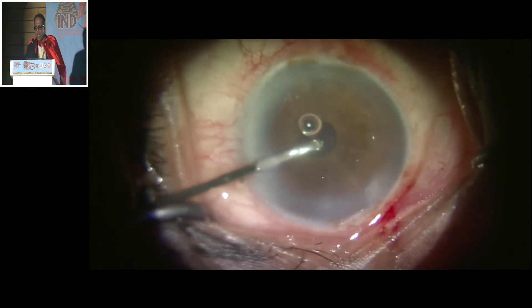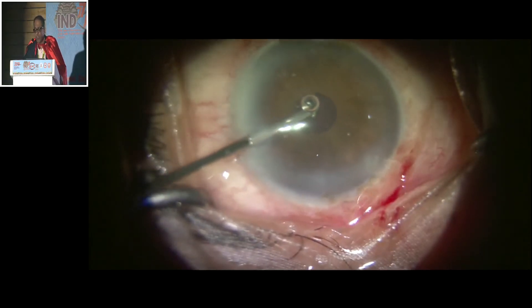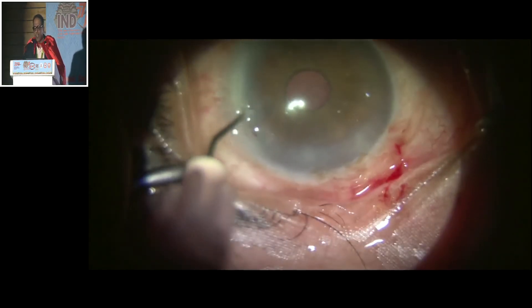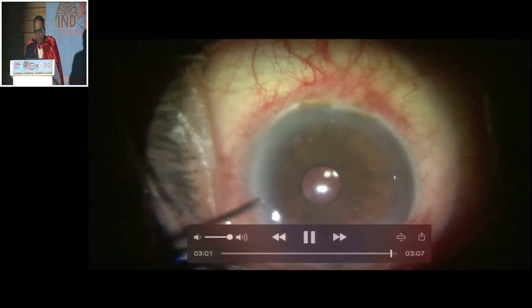Vitrectomy is done. The case which seemed hopeless, using new innovations for the first time, I am rechecking and find that I have been able to put it through successfully.